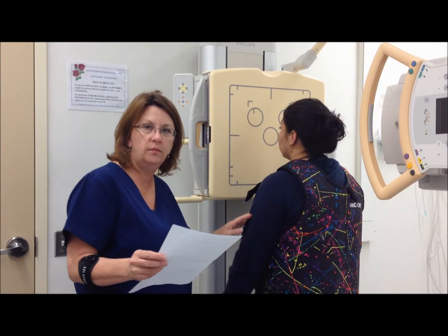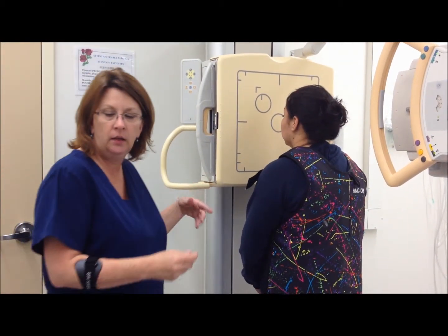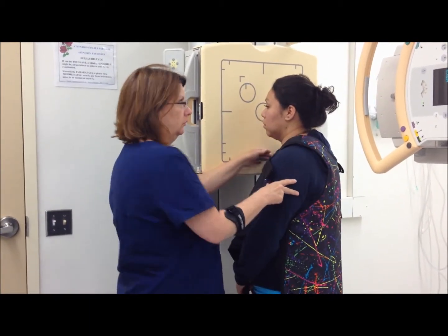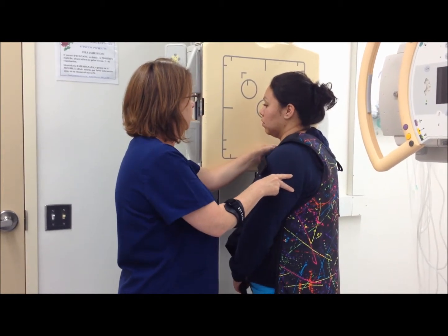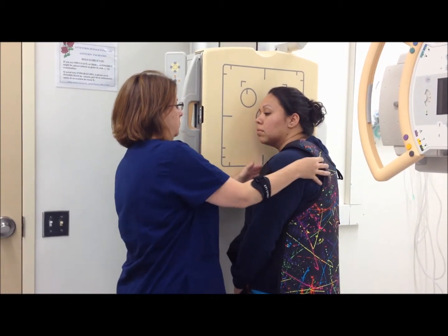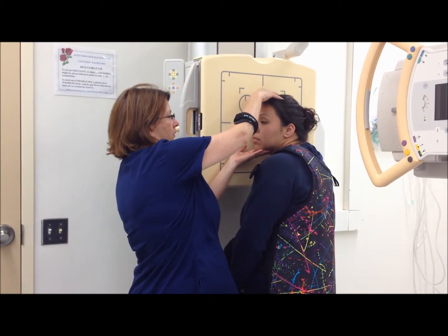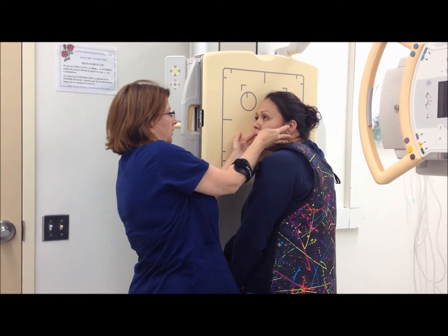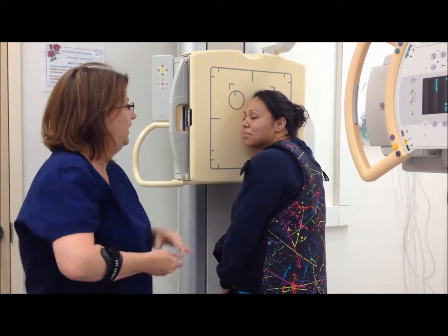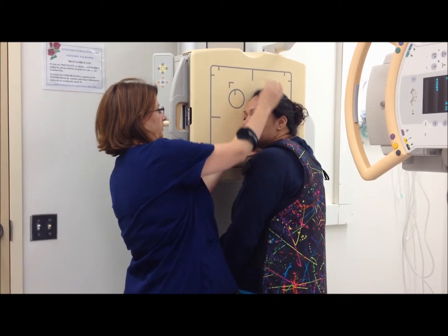Okay, now for my next image, we're going to be doing a lateral, also on an 8x10. Patient is going to be in an RAO with her face turned laterally, and I want to keep her interpupillary line horizontal. Mid-sagittal plane is parallel to the IR.